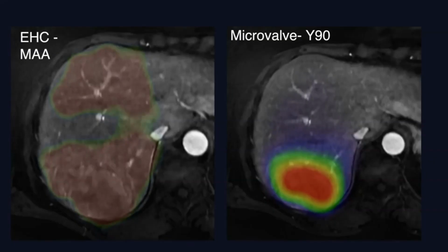Now they actually have a CPT code that you can use during the mapping procedure to get reimbursed for using something like a TriNav, for instance. So I probably in the future would have used it there, but they didn't have a code then, and so I didn't use it. But I knew I was going to use the microvalve when I brought him back, because if nothing happened, whatever. But if I can get any increased uptake into the tumor, anything at all is going to help this scenario, right?